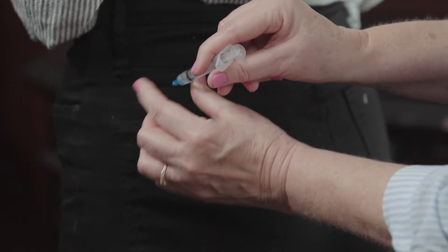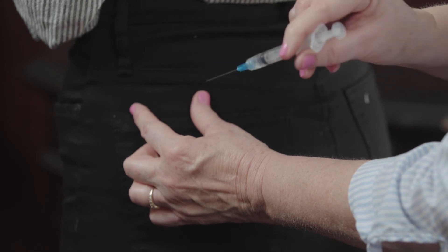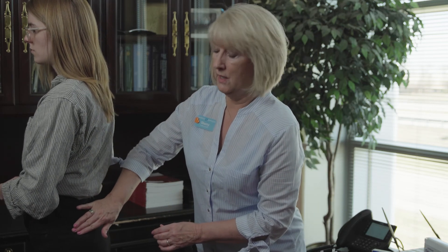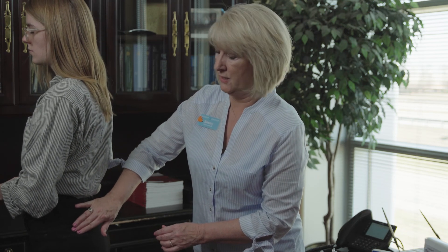Once it is all the way inserted, you will stabilize the syringe with your non-dominant hand and push on the plunger to inject the medication. Once the medication is fully injected, you will just pull straight out. You will discard the used needle and syringe, and you can go ahead and gently massage the tissue to allow the medication to disperse out of the muscle to prevent tenderness.